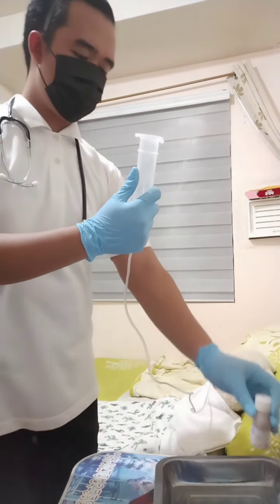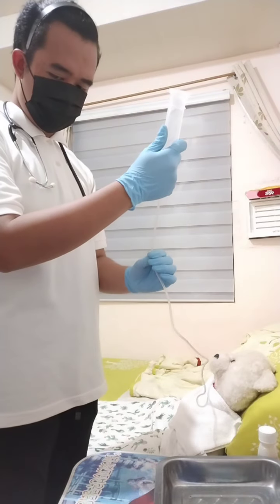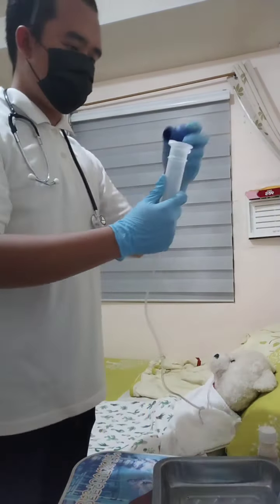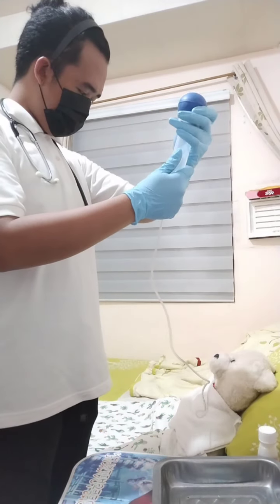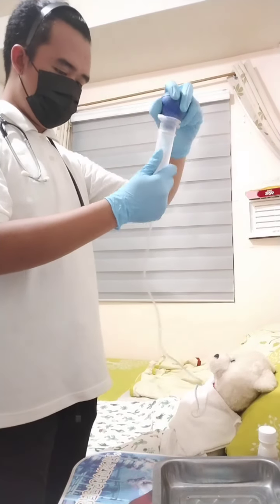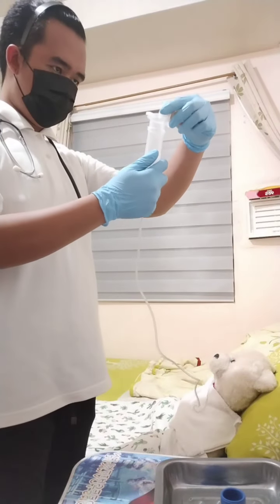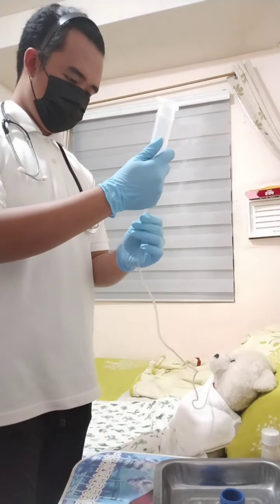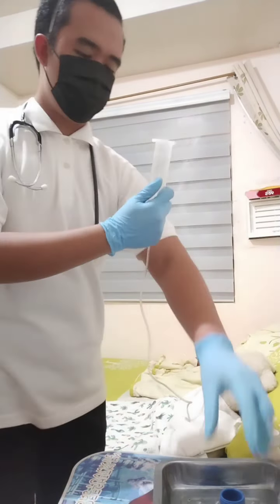Refill. Repeat until the prescribed amount has been delivered to the client. Gradual emptying of the tube feeding by gravity from the syringe or feeding bag reduces the risk of abdominal discomfort, vomiting or diarrhea induced by bolus or too rapid infusion of tube feedings. If a feeding bag is used, hang the feeding bag on an IV pole. Fill the bag with the prescribed amount of formula and allow the bag to empty gradually over at least 30 minutes.